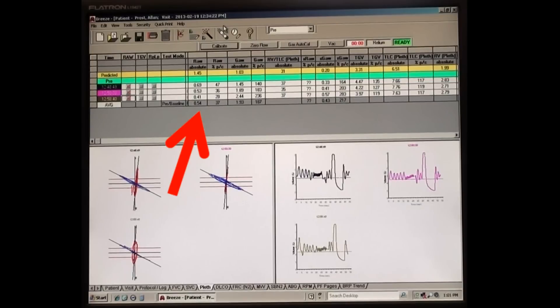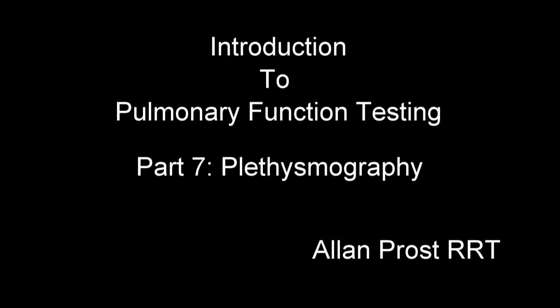Once we have three of these tests completed, we're going to start reporting our data. With this plethysmography, we can determine total lung capacity, which is very useful in determining lung health. We can also determine the resistance - that's done with the shutter open during the panting maneuver. With the shutter closed, we're actually measuring thoracic volumes. So that's why we're doing those panting maneuvers. This was a quick review of plethysmography and pulmonary function testing. Thank you very much.